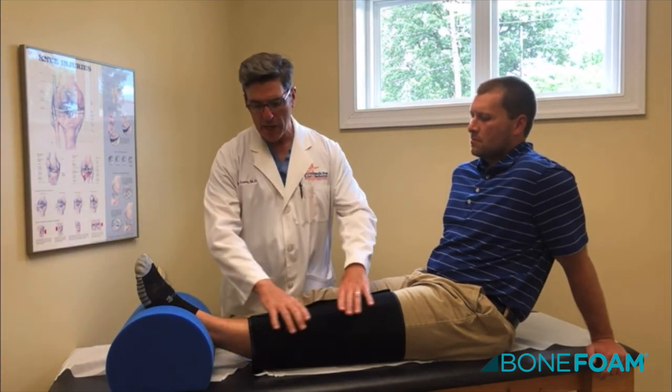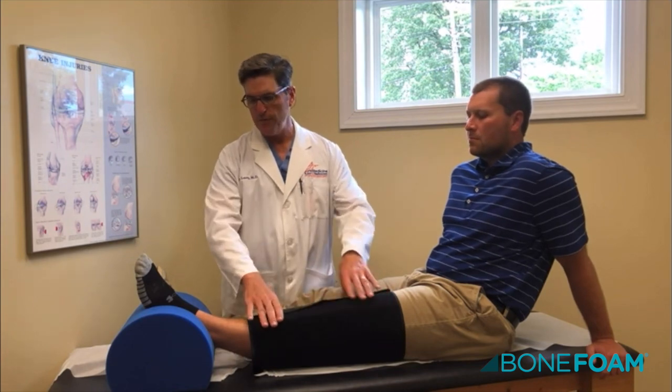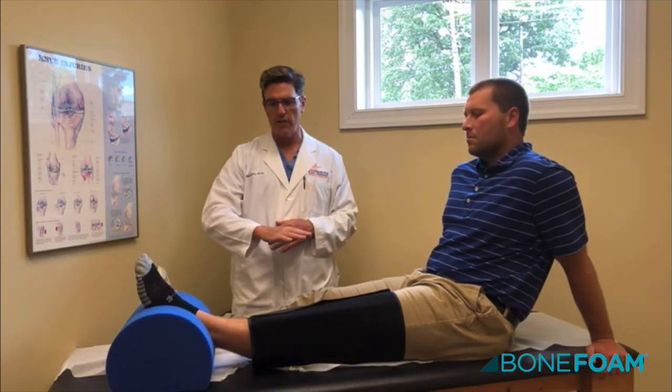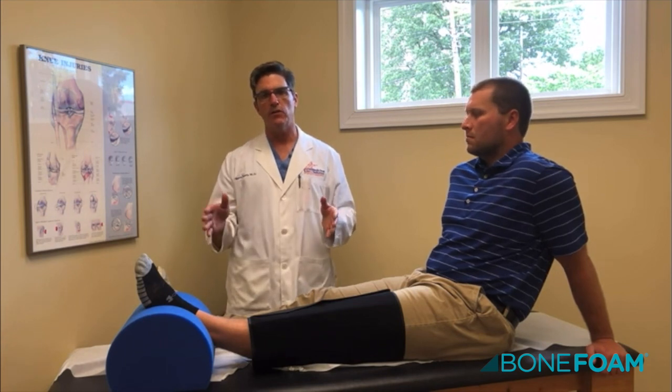You have the ice pack on your knee that was given to you in the hospital. Just get it out of the freezer, put it on, and put the foot in the Bone Foam. Make sure there's a little bit of space under the knee so it drops down to zero degrees. The goal is one hour — 30 minutes minimum, 60 minutes maximum.